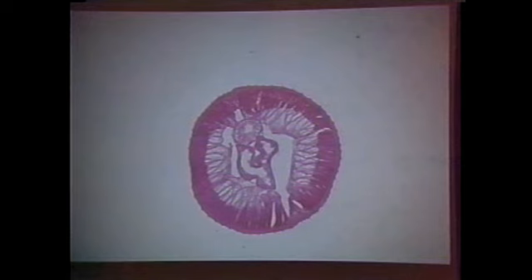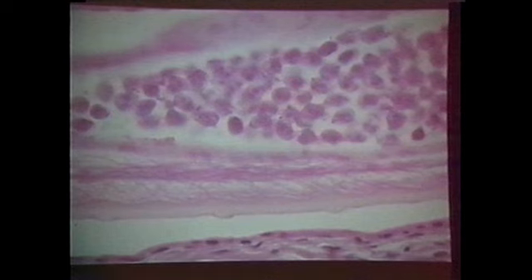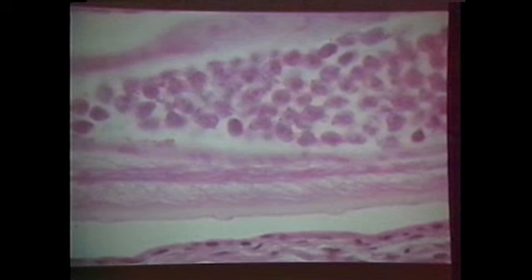All right? That is to be contrasted with this worm. And you'll find out why that's important later. But this worm, this is a longitudinal section. This is a section this way. It's not a cross section. So if you cut something this way and you have evenly spaced ridges, you know that those are rings going around the body of the worm. You see, that's different than the longitudinal ridges. You have annular cuticular rings.